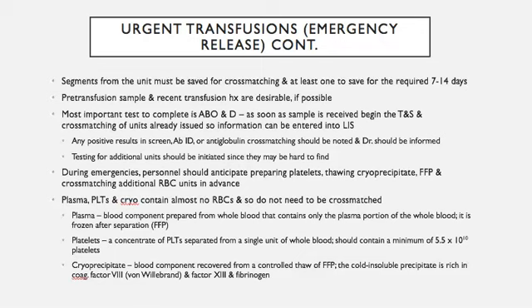You also still have to save segments from that unit because you are going to be cross-matching that blood. You just haven't gotten that patient sample yet. So you're going to save segments so that that cross-matching can be done. All that information still has to be on file. And you want to save at least one segment for that 7 to 14 day hold in case there is a transfusion reaction. So pre-transfusion samples and a recent transfusion history are desirable if that's possible.